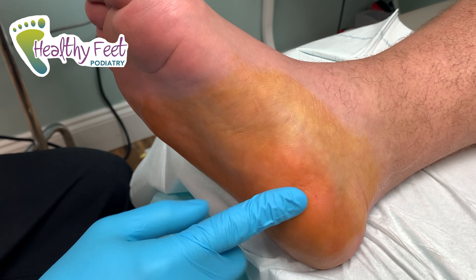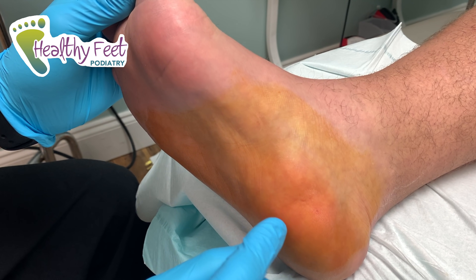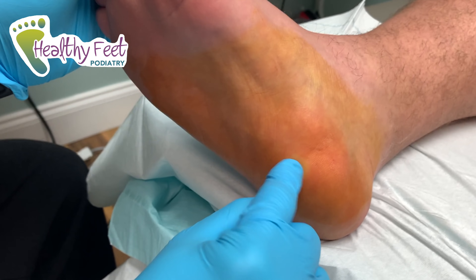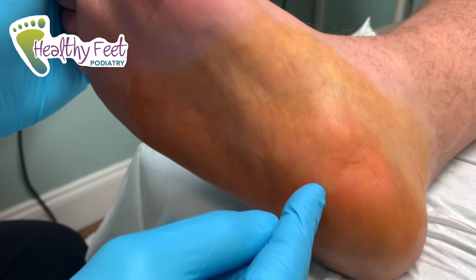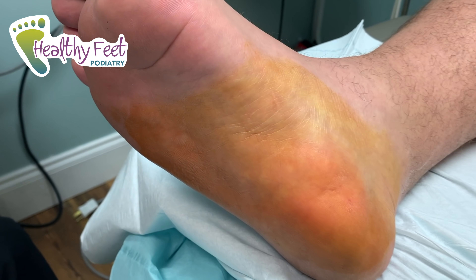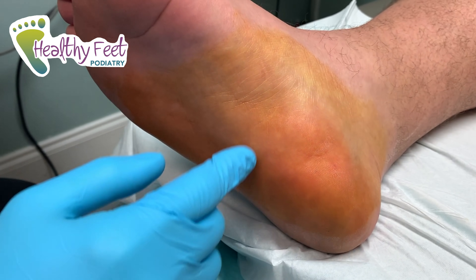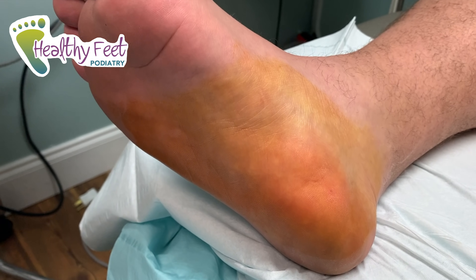That pull causes inflammation and pain. What we do is make a little stab incision and cut about a third of the plantar fascia, which loosens it up and gives us some slack. Later, when he steps down, that's not going to create that pull or cause that inflammation and pain. So we're going to get started.